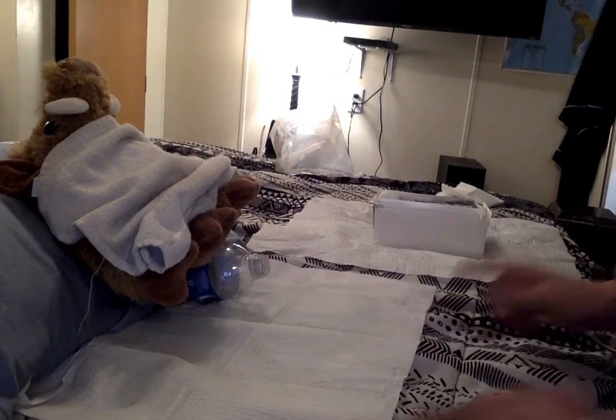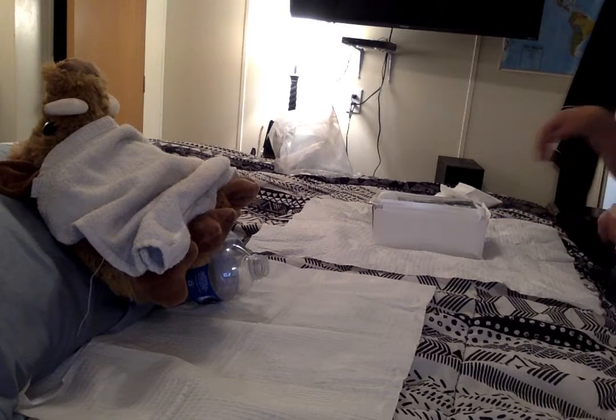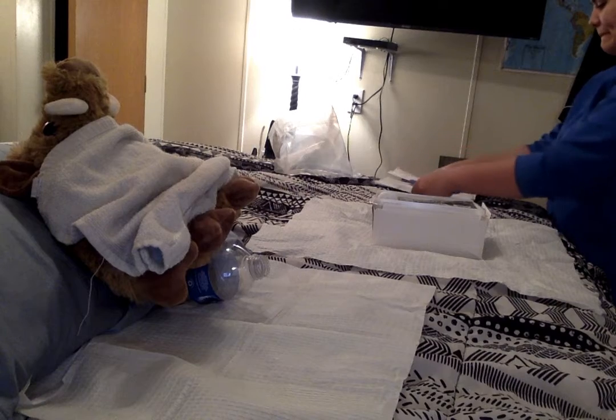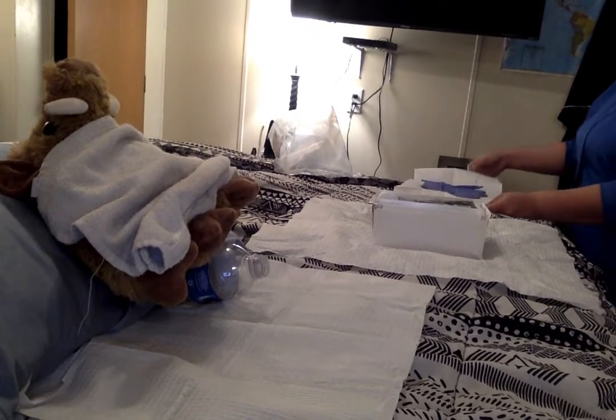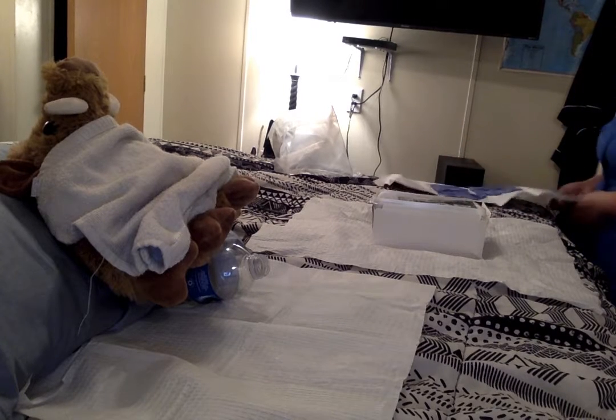So now, we are going to perform our hand hygiene, make sure our hands are nice and clean, and we're going to apply our sterile gloves. Making sure not to contaminate anything, we're going to grab our sterile gloves.